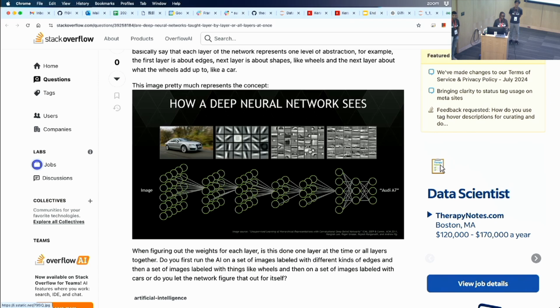But we don't have enough data. So for medical imaging, you will always be doing fine tuning. You will be picking a model that's been trained on cats and dogs or something else, but that's changing. That's what Harry is saying with the larger foundation models or the embeddings, as you'll see this afternoon, and you're just coming back to do this final training.